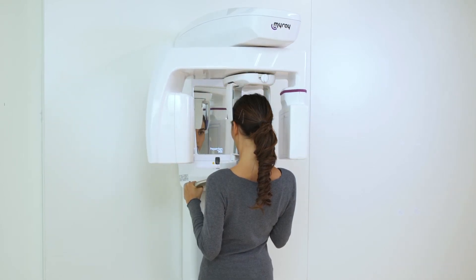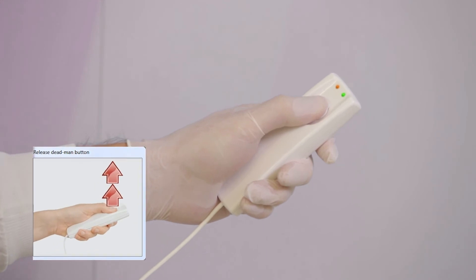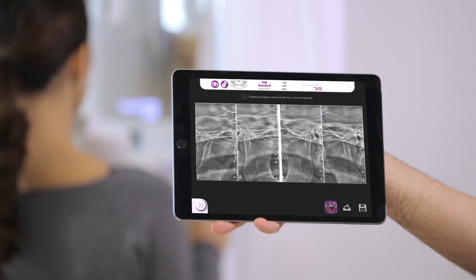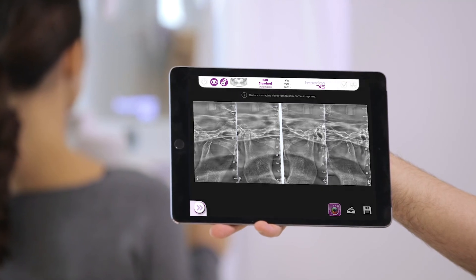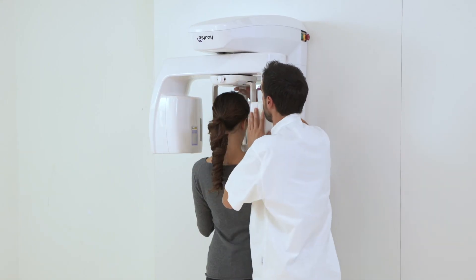After the scan is completed, a message is displayed on the virtual console to inform that the button should be released. A preview of the X-ray image is immediately displayed on the virtual console. The scan has been completed.